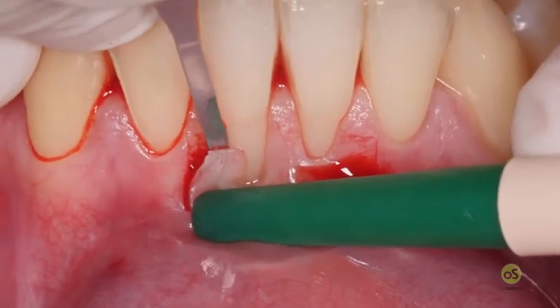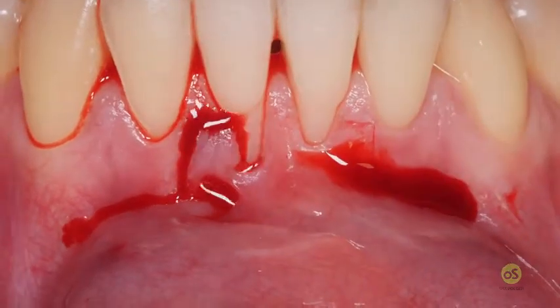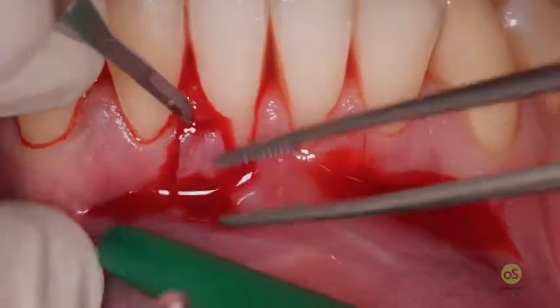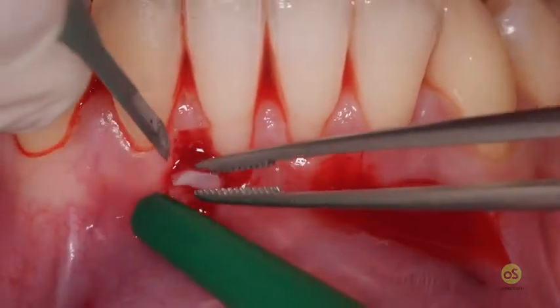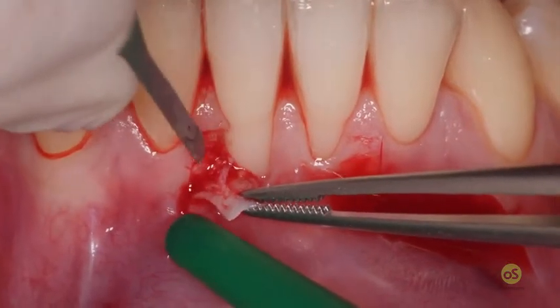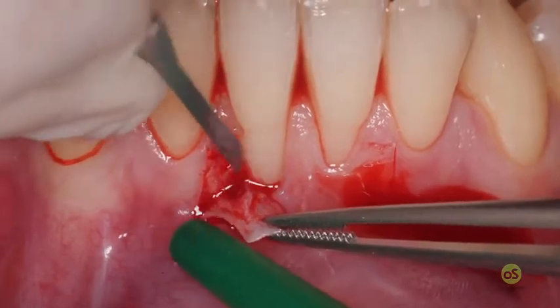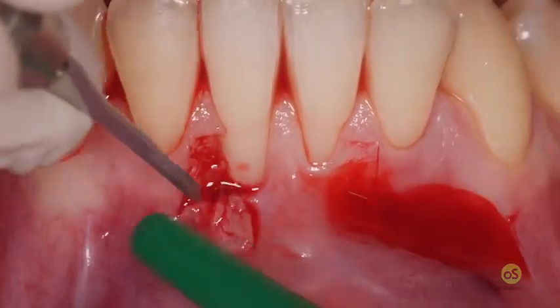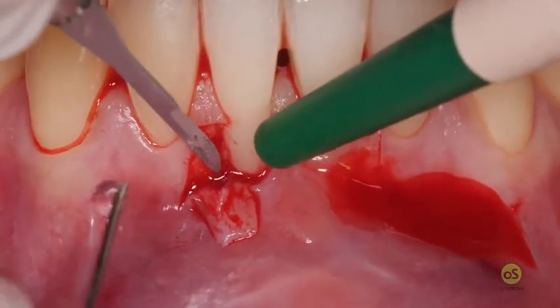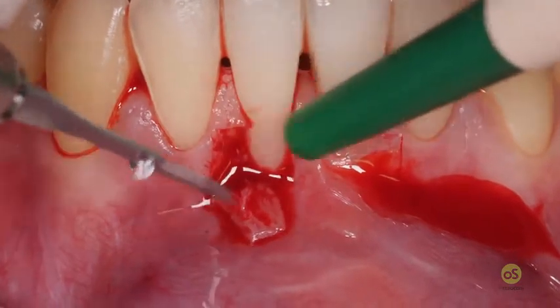Very, very difficult papilla. And once the most coronal aspect of the papilla can be elevated, I finish my split thickness elevation of the papilla, keeping the blade parallel to the bone until the imaginary line connecting the gingival recession to the vertical release incision is reached. So this is the first surgical papilla.